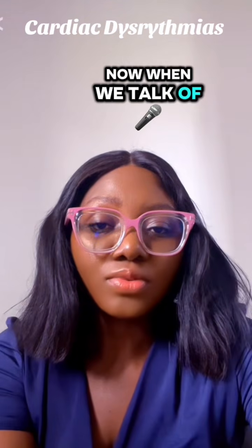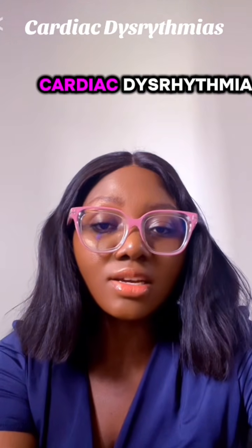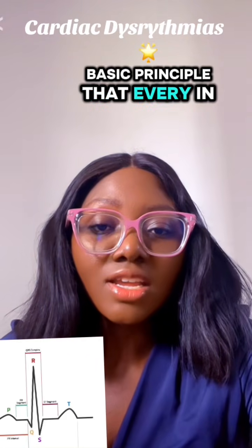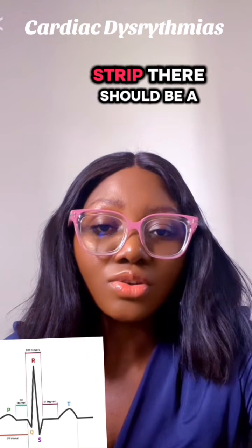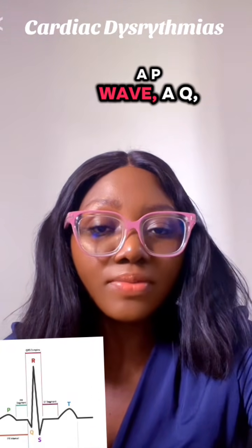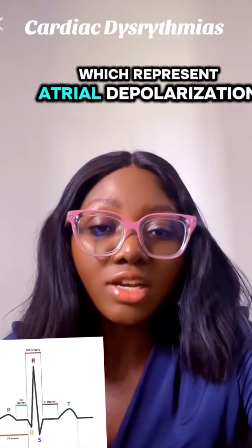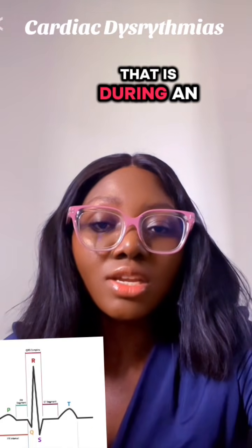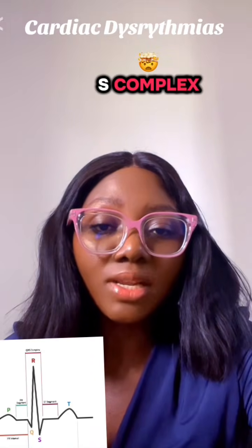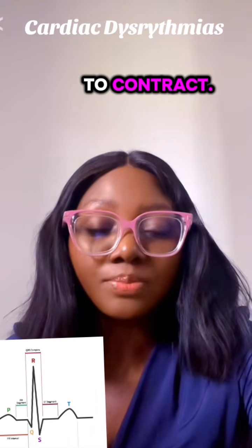Now, when we talk of cardiac dysrhythmia, before you even think of reading or interpreting any cardiac dysrhythmia, you should know this basic principle that in every EKG strip there should be a P wave, as you can see on the screen. A P wave, a QRS complex, and a T wave. So a P wave, which represents atrial depolarization, that is during an electrical activity when the atria contracts, and then a QRS complex also represents an electrical activity that causes the ventricles to contract.